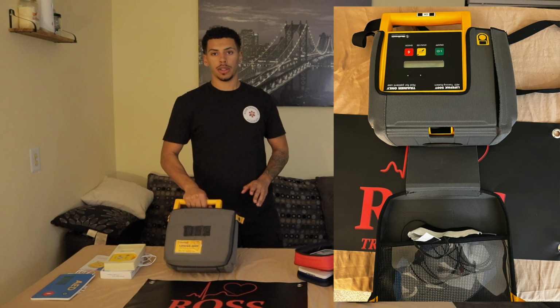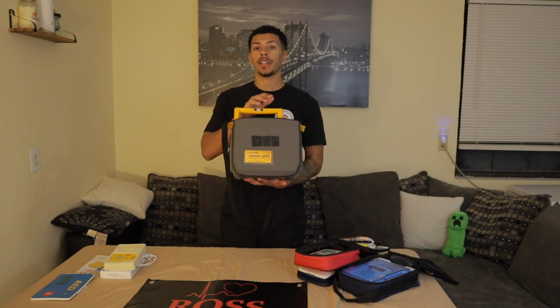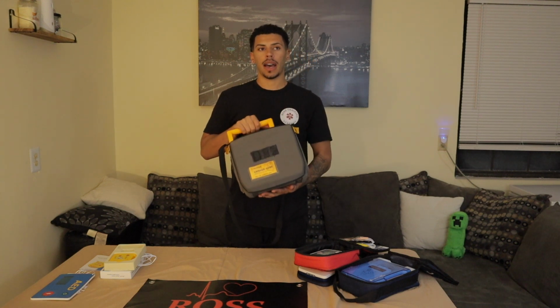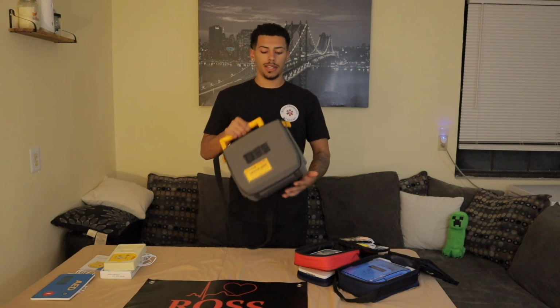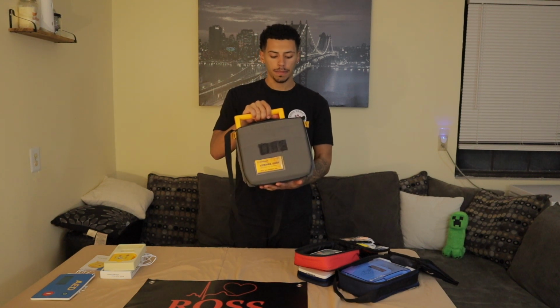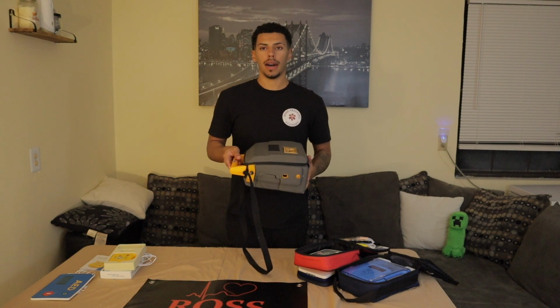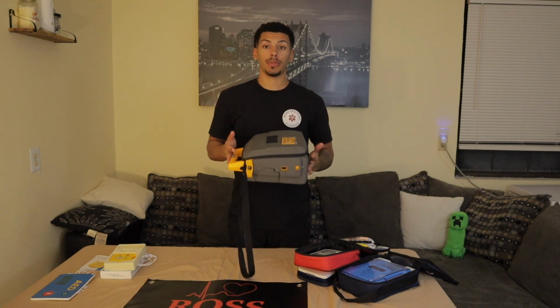Next, we're going to take a look at this one here. This is going to be the LifePak 500T, or Trainer. I don't even believe the LifePak 500 is approved by the FDA anymore, so you're probably not going to want to really get this thing. It does still work as a trainer AED, but because the real ones aren't being used anymore, you don't need the hands-on training with this one in particular.